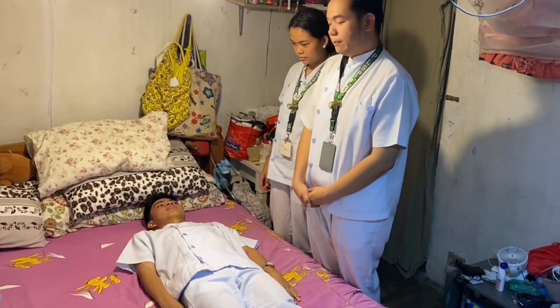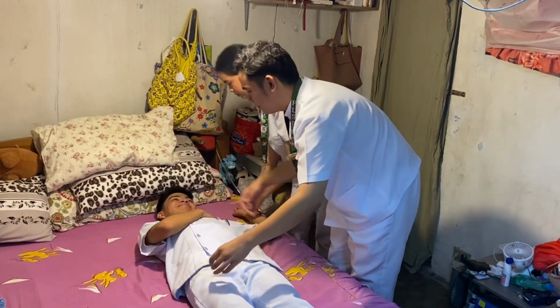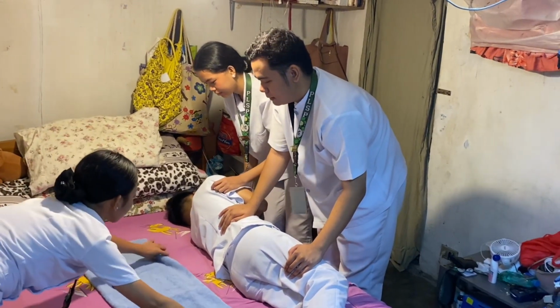So we will put the patient in a lateral position. And then another nurse will put the friction reducing device.